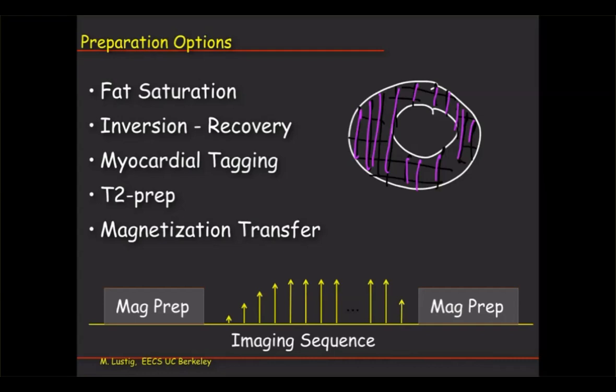Remember, for T2 weighting, you have a very long TR, right? Because if you want to have pure T2 weighting, you have to excite, and wait 80 milliseconds or so. You have to have a spin echo, right? If you want not T2 star. And then after 80 milliseconds, you do a readout. And then now you have to wait till the magnetization recovers completely. That is very, very slow. Okay, so we're talking about very long TRs and very long TEs. It's not very efficient.